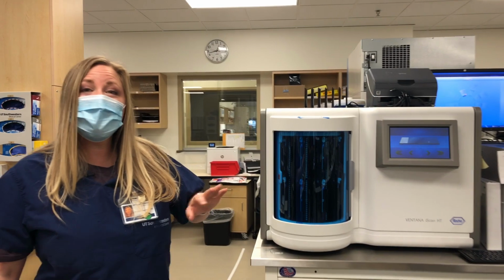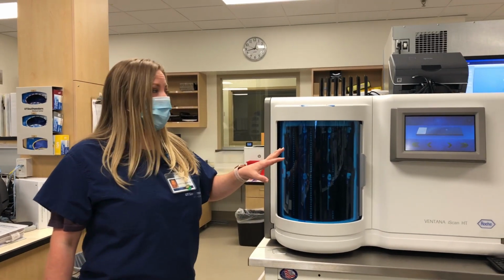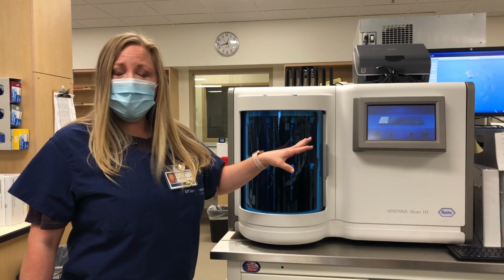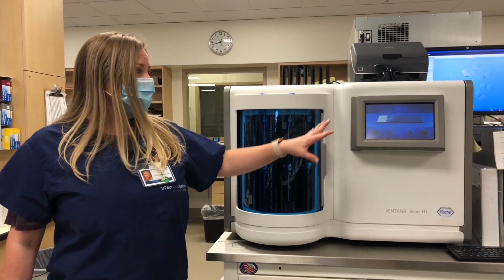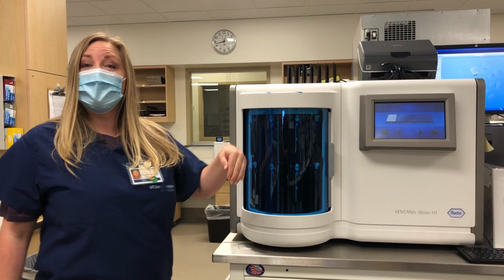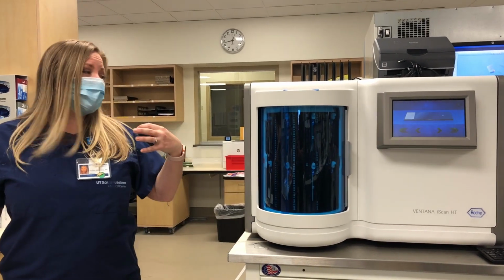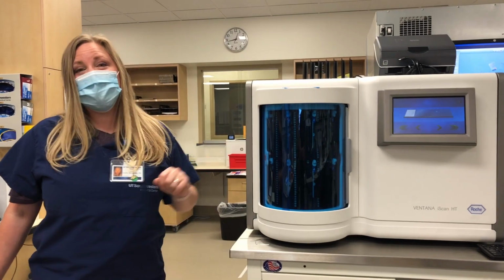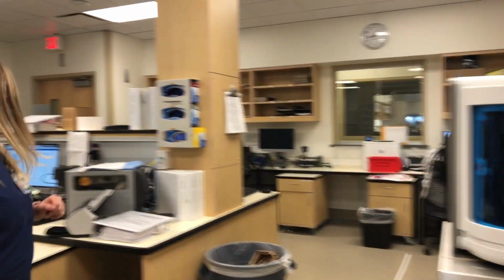We also utilize scanning for a lot of our slides if you cannot be actually here in person, either to do consults or currently, as we have some people off campus, we can actually put slides into our slide scanner and send those out for consultation. And it's used very much the same way an electronic microscope is used. So we get to use a lot of cool technology here as well.